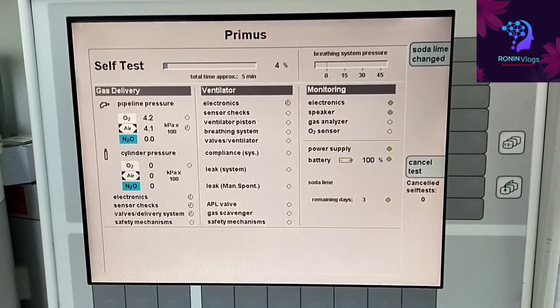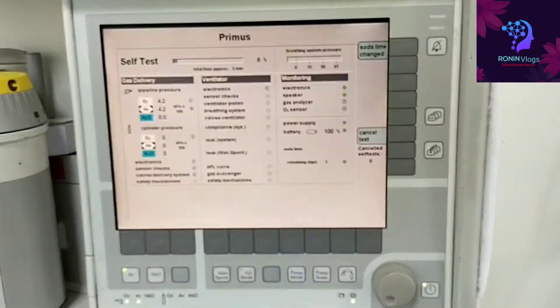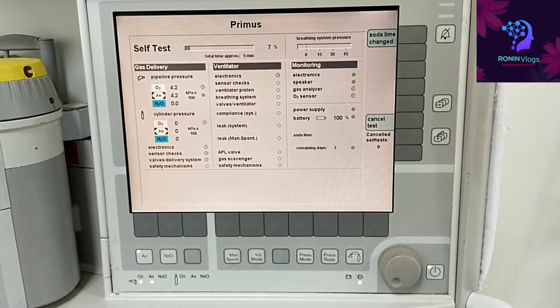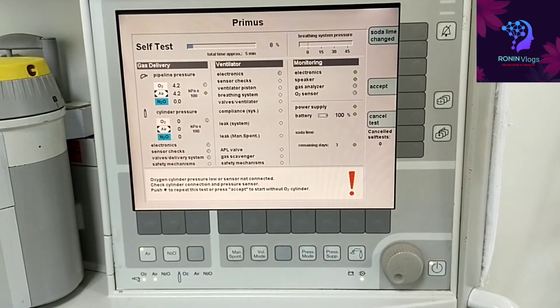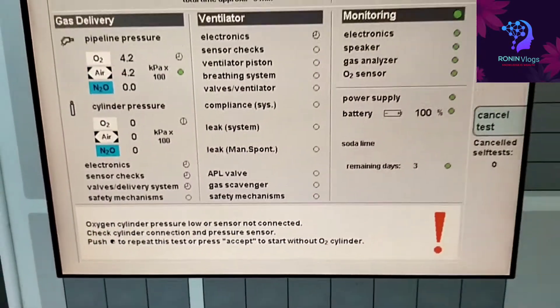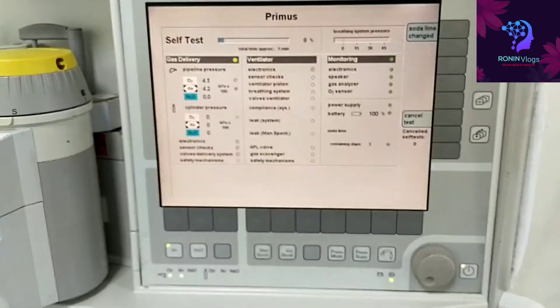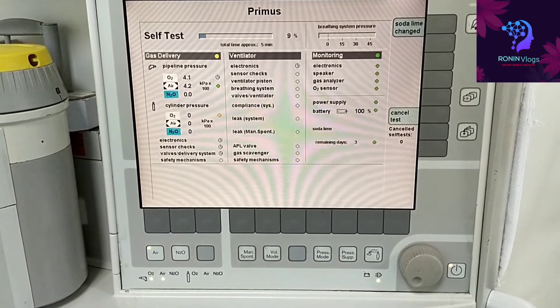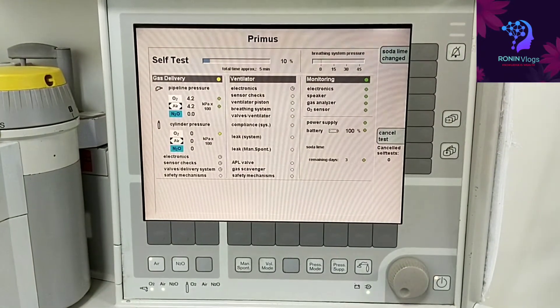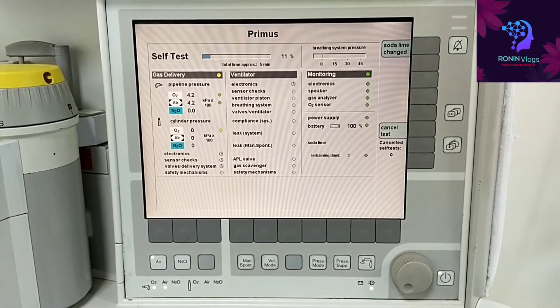Since the cylinder is not connected, a message will appear — we need to accept it. The process will go up to 100%, completing the full self-test check. The message about the unconnected cylinder comes out and we accept it. The electronic speaker, gas sensor, and battery are all being checked. If checking is complete and passing, it will show in green; if it is in red, that part is defective and the machine will not function; if yellow, it is partially functional.